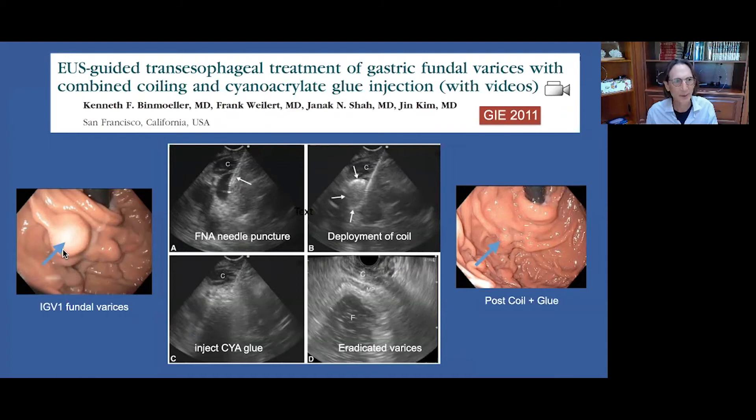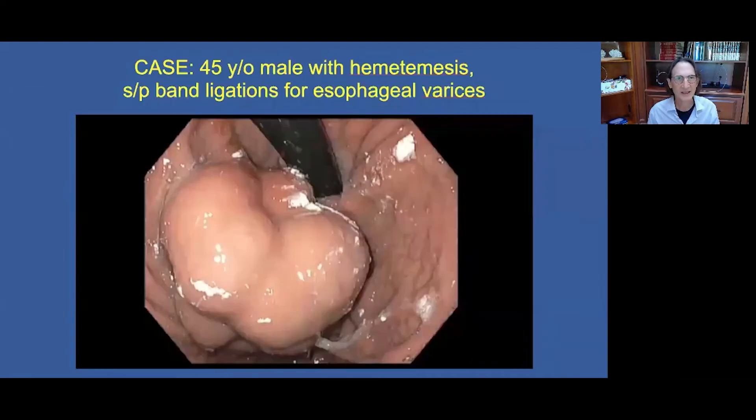Here is an example of a fundal varix. We puncture the varix with a 19-gauge needle, deploy the coil within the varix as a scaffold to retain the glue, which is immediately injected afterwards through the same needle. The glue is very echogenic so we can see the lumen filling. In follow-up, we can see that the varices are eradicated both on EUS and on endoscopy.